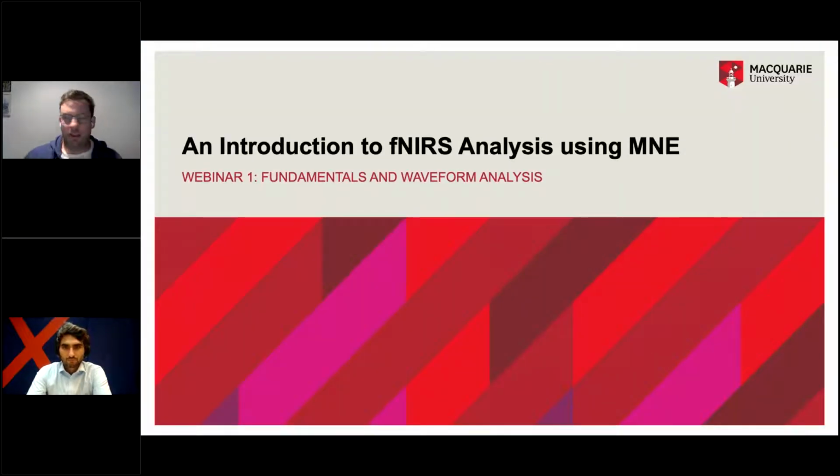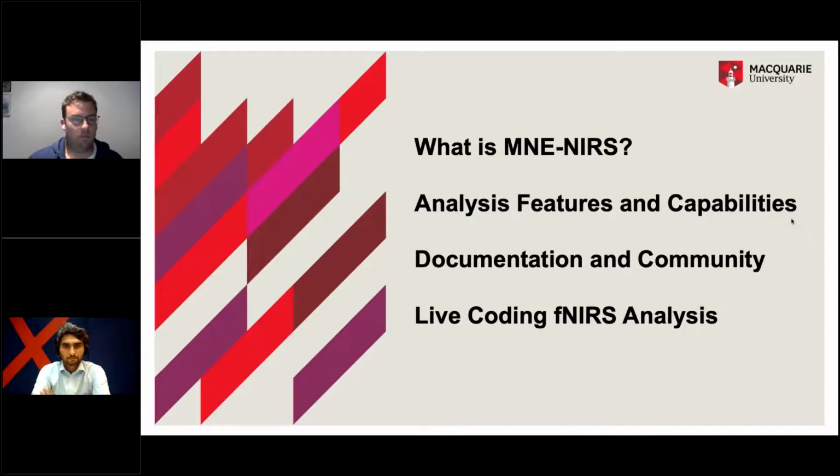And so thanks for attending. We'll go through an introduction to fNIRS analysis with the MNE toolbox today. First I'll describe what the MNE toolbox is. I'll go through the features and the capabilities that it has, and I'll show you the website where you can find out more details about these different features.